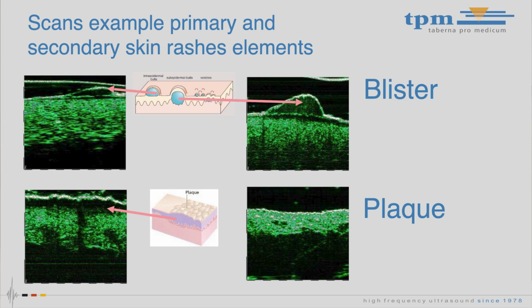The ultrasound scanning is actively used by dermatologists all over the world, allowing to expand the diagnostic capabilities of visualization not only on the skin surface as in dermoscopy, but also throughout the depth.